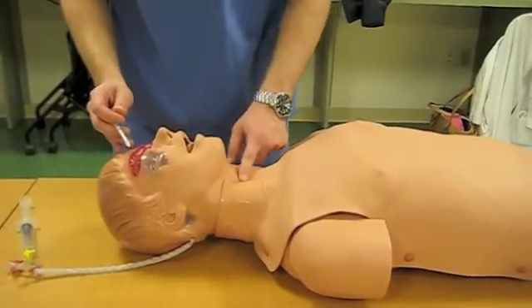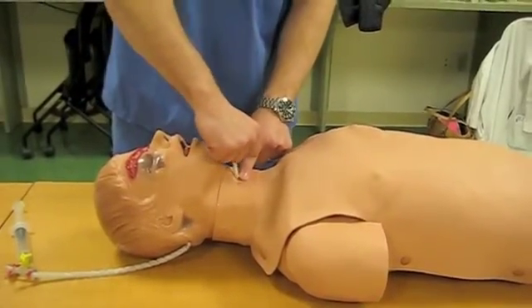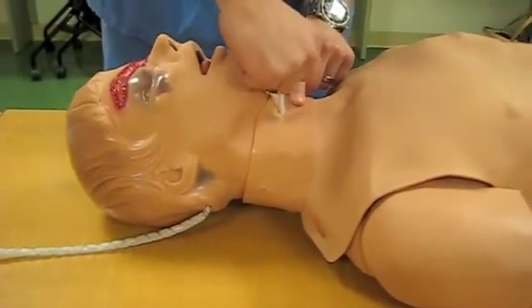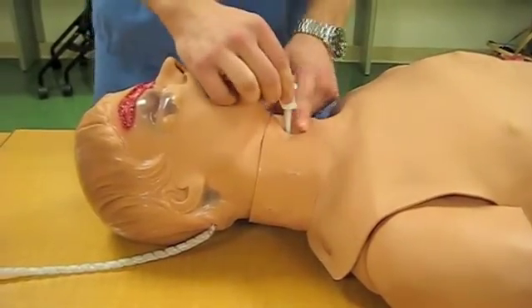First, just palpate down, palpate the cricothyroid membrane, then push the catheter and the trocar in a caudal direction through the skin until you feel it advance through.